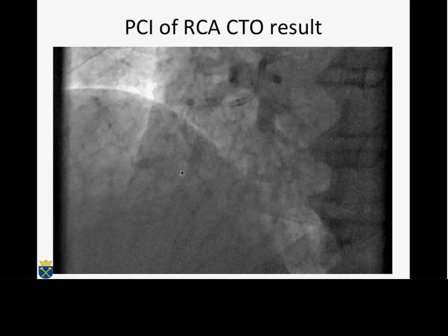That was very nice. Do you need a special landing zone? How much space do you need to be able to advance the device? Do you need 10 millimeters, 15 millimeters? It looked like you didn't have much RCA there. Three centimeters is necessary, three or more.